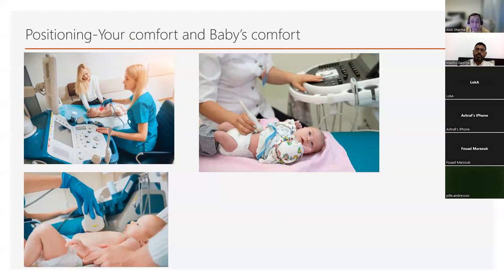And for this baby, I'd probably try and get some sucrose, have an assistant who's assisting me to try and get the hands out of the way when I want to do that. But more importantly, when I turn this baby around, I'm going to have to wait half an hour to get the posterior regions because this baby has been supine. Now, what about if this baby's prone? What can I do?